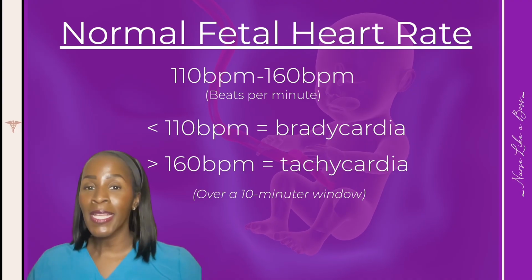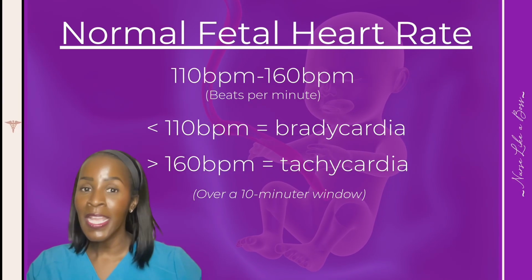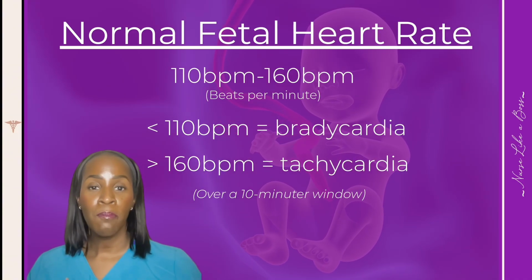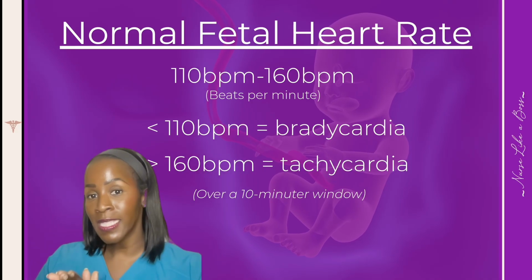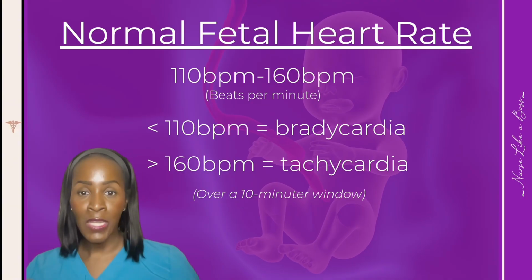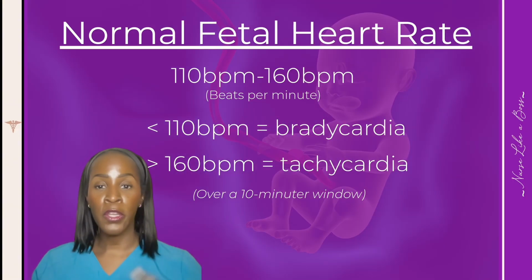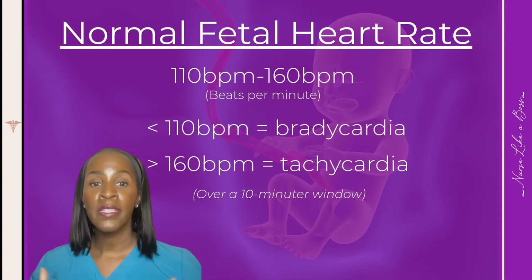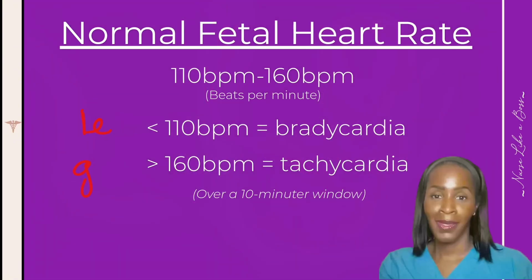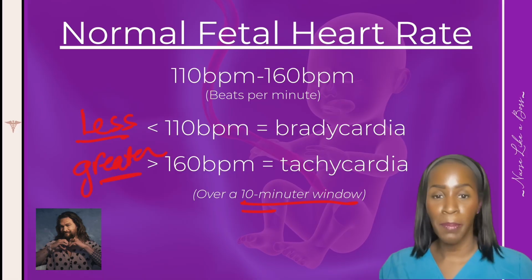In healthcare, we like to say that you should know what normal is, because if you know absolutely what normal is, then you'll be able to identify when something is abnormal. The normal baseline fetal heart rate is anywhere from 110 beats per minute to 160 beats per minute. Anything less than 110 beats per minute is fetal bradycardia, and anything greater than 160 beats per minute is fetal tachycardia. Again, this has to be evaluated over a 10-minute window. And just in case you're not good with your less than and greater than signs, I did write it out for you to refer back to.